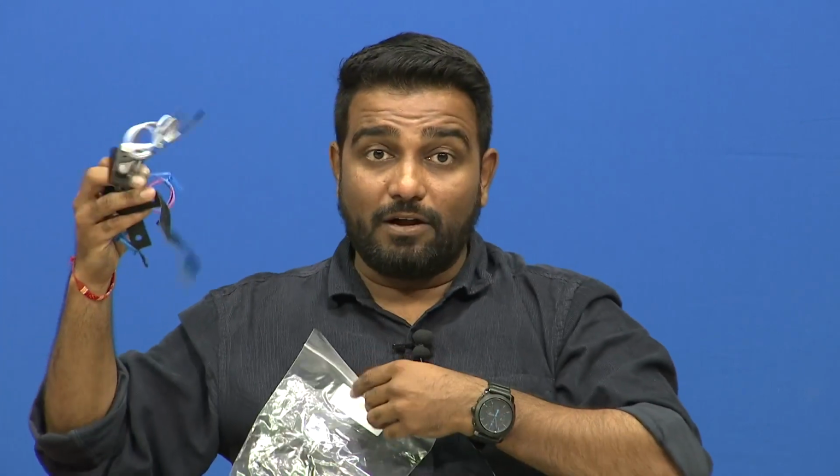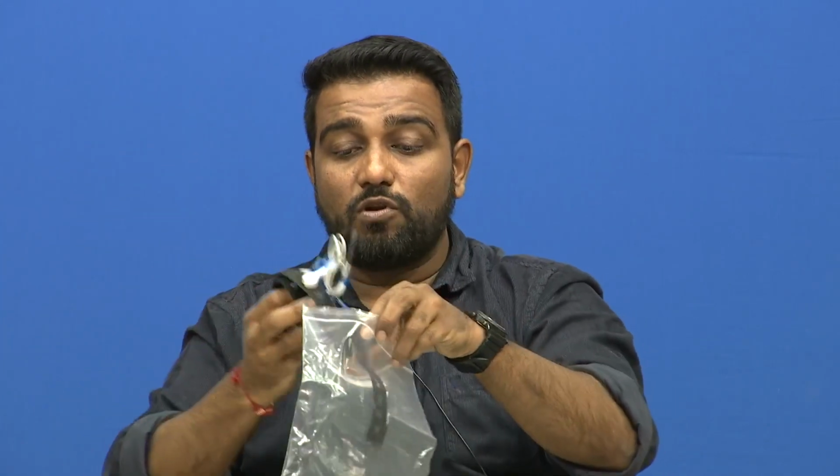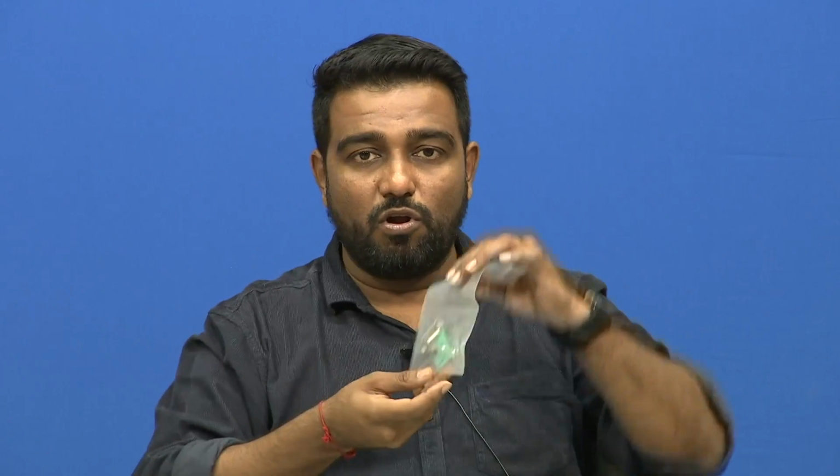Now, you can connect this one to the electronic conditioning circuit, and then we can use it for measuring the EEG. Now, we will also see how we can design the electronic conditioning circuit, because that is more of our interest, rather than understanding how the electrode looks. But whenever you want to design any electronic module, you have some kind of sensor or transducer, right. So, that signal only you are amplifying. So, you need to know what is the principle behind that particular sensor, then only you will understand how you can design the electronic module accordingly. I have the electronic module with me, I will show it to you once we see the slides.